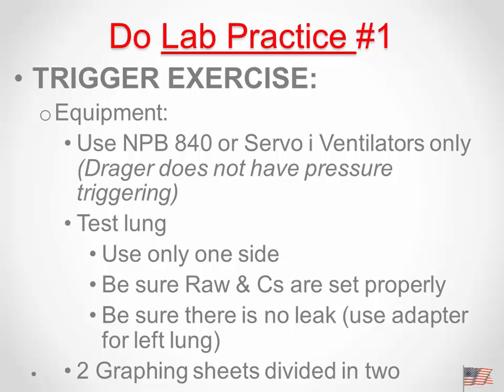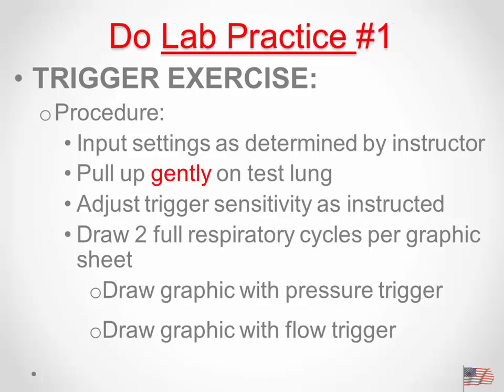And you're going to have those graphing sheets. You should have settings that are there. We're going to pull up gently on the test lung to simulate a patient trigger and adjust the triggering sensitivity. And again, you're going to try to draw what the ventilator is displaying.